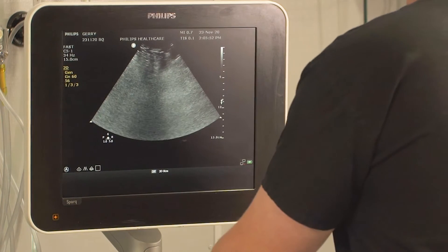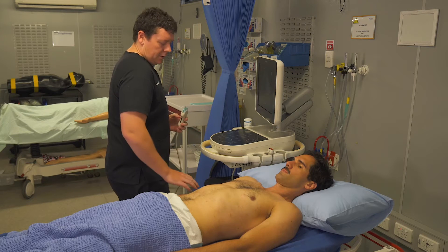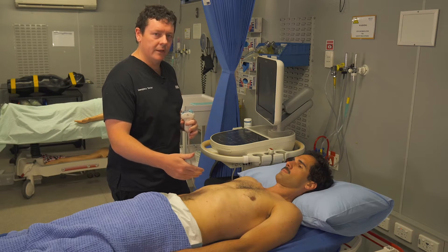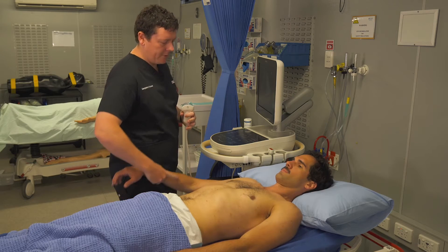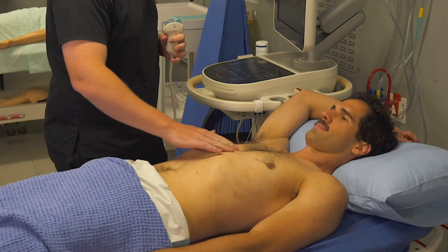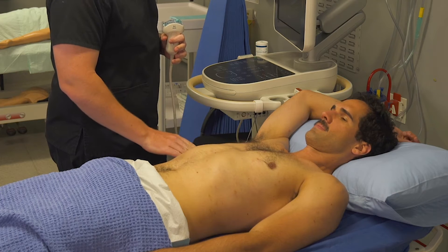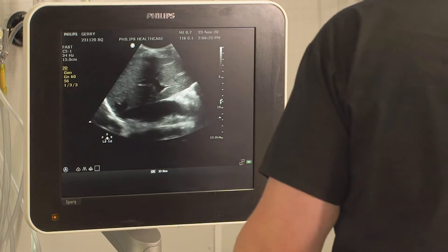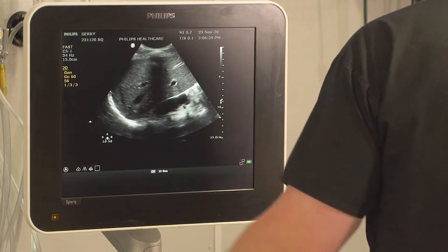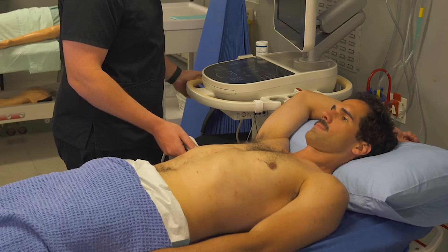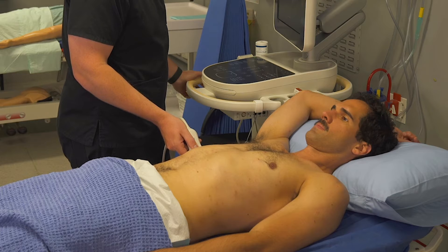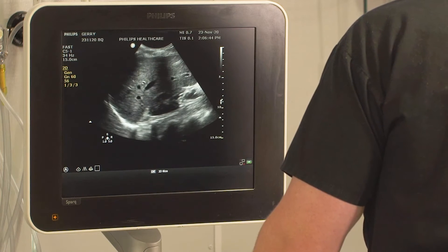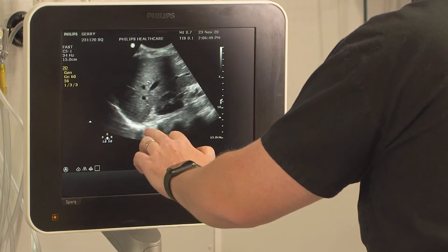I've pre-gooped our curvilinear probe. Always start with the right upper quadrant. For eFAST scanning it's always worthwhile doing your surface anatomy first. Get the patient's arm up, palpate the xiphisternum, then go all the way across to the mid-axillary line. Probe marker to the patient's head end — pop it down and see what you can see. You should be able to see liver, with some diaphragm, and fanning the probe back should catch some kidney. Try to get spine as your backstop.